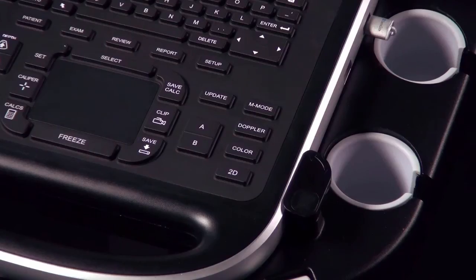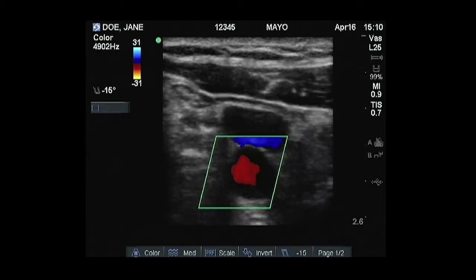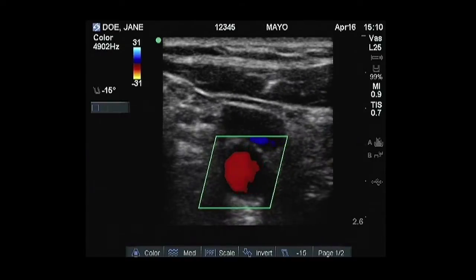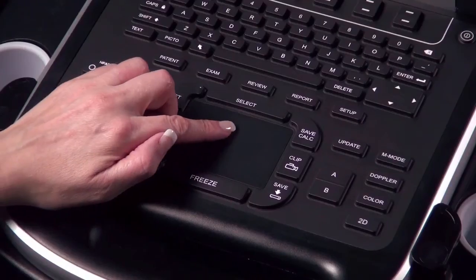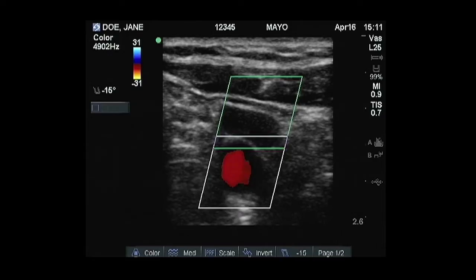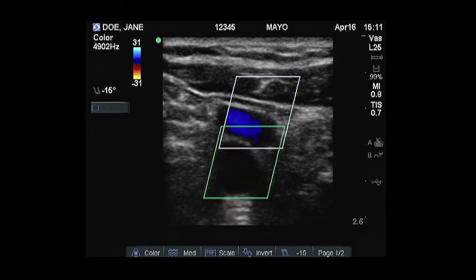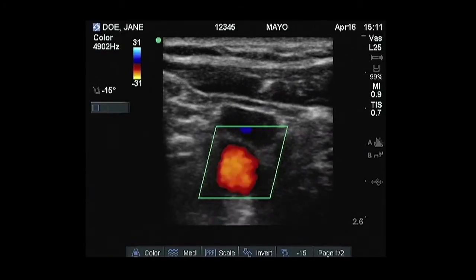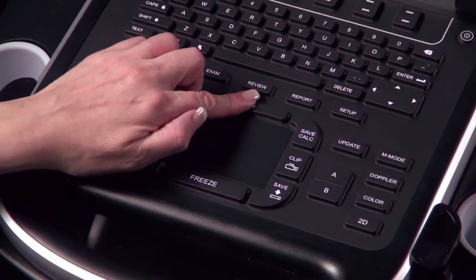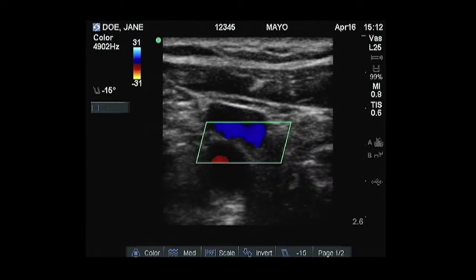Press the Color key to activate color Doppler or color power Doppler. A region of interest (ROI) box will appear in the center of the screen. Use the touchpad or arrow keys on the control panel to change the position or size of the ROI box. Use the Select key to toggle between changing position or size of the ROI box.